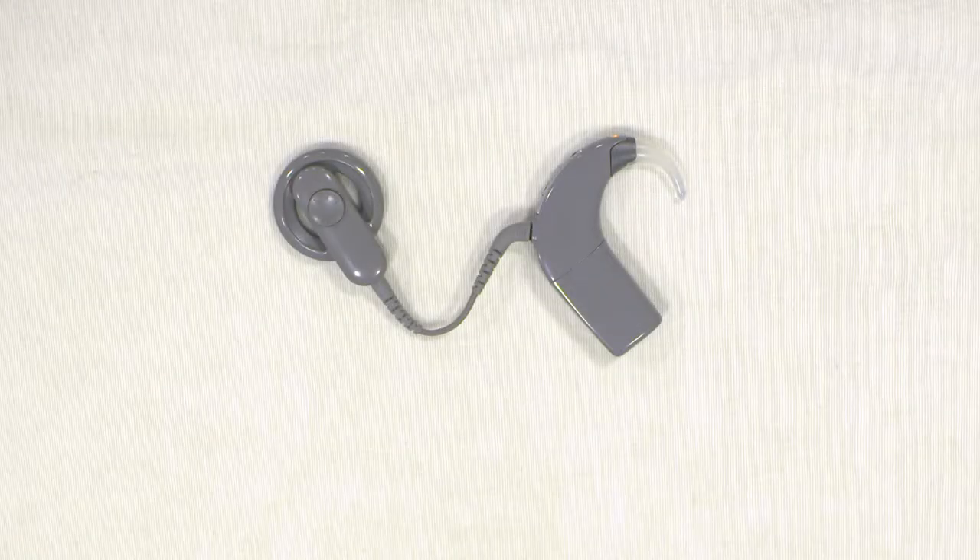Hi, my name's Sue and I'm a clinical scientist here at the University of Southampton Auditory Implant Service. I'm going to talk through some of your equipment today. This is the Nucleus N6 or CP910 speech processor. I'm going to talk you through how to take the equipment apart, put it back together, and troubleshoot for any problems.